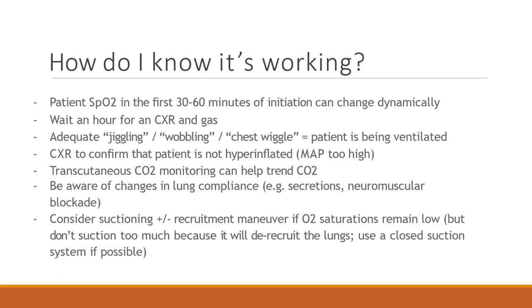There are times when the SATs will go down before they go up, and we have to go up on the oxygen before we can start weaning it, because we're doing a different kind of ventilation here and we're only inflating to that mean airway pressure, whereas when we were bagging and doing all of that, it was a little different. Okay, so we want to give it like that hour, maybe a half an hour, maybe 45 minutes if it's working, for that X-ray and gas.